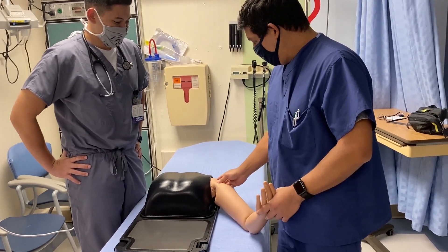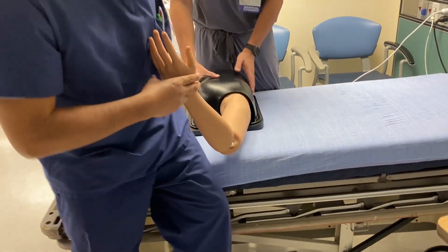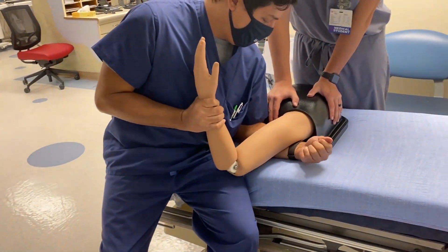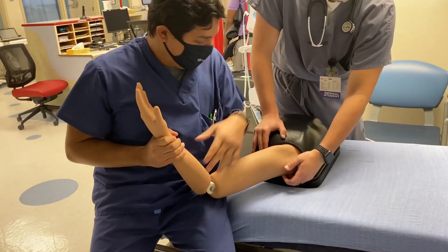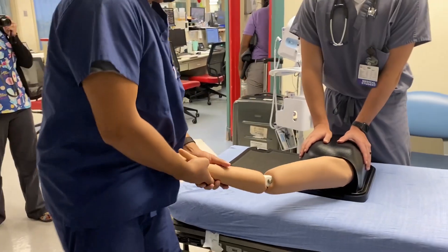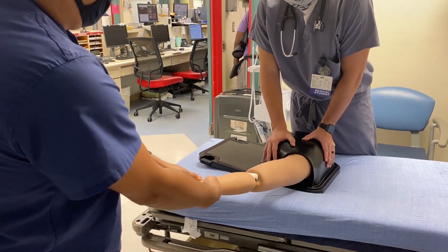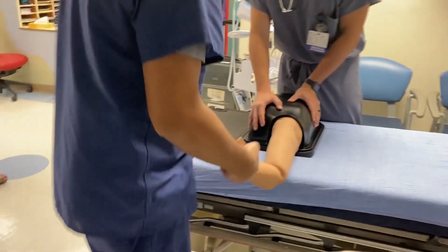We're going to start with the Fares technique. Go ahead and dislocate it — grab over the wrist, push it up, and you can feel that it's out. Okay, so you've got an anterior dislocation. For the Fares technique, you're putting traction on, then winging it up and down, and it popped in.